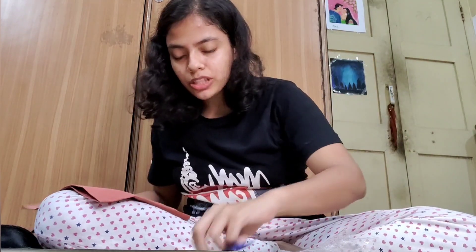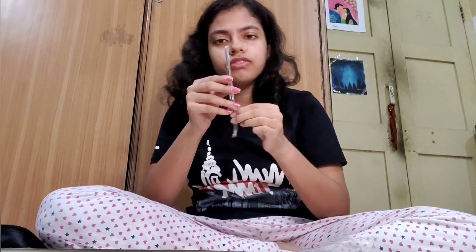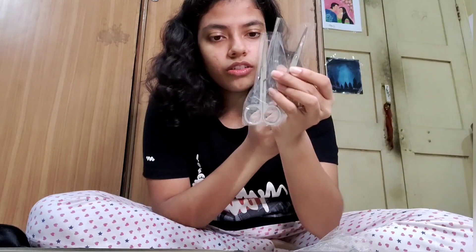Then we got another spatula for mixing of the plaster. And we have this forceps and two scissors.